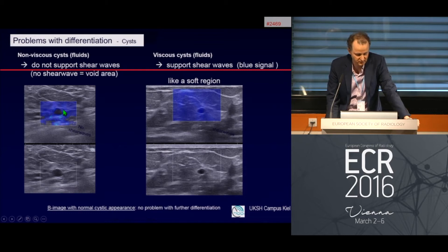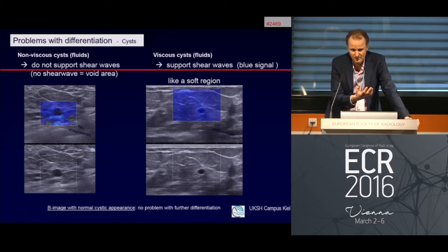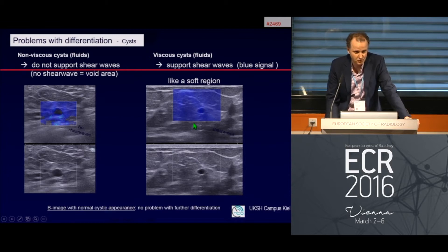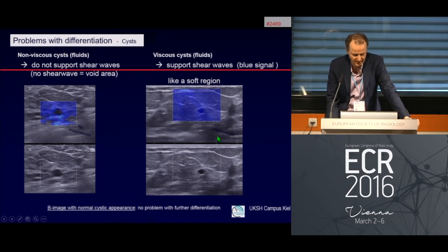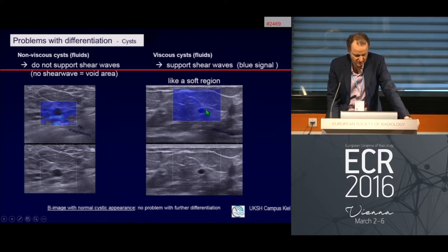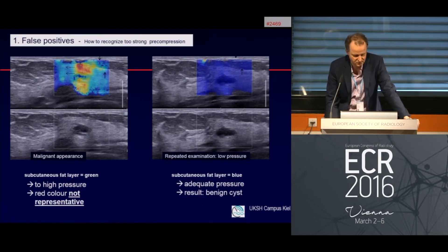Another case: a cystic lesion where there is a void area — no shear waves in the fluid — which is also characteristic of a benign finding. This is especially important in daily practice since many patients have cystic lesions. Recognizing this helps prevent patients from shorter follow-ups. This also applies to viscous cysts, which show a homogeneous blue signal indicating a soft region.